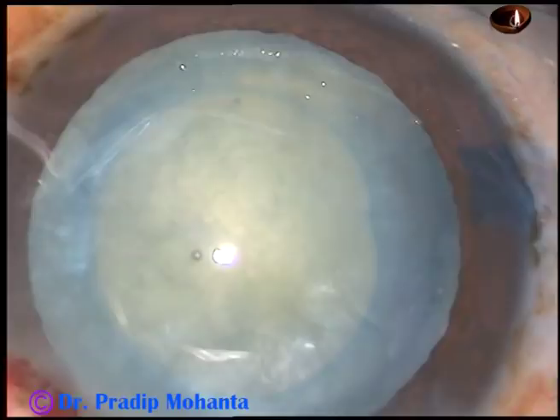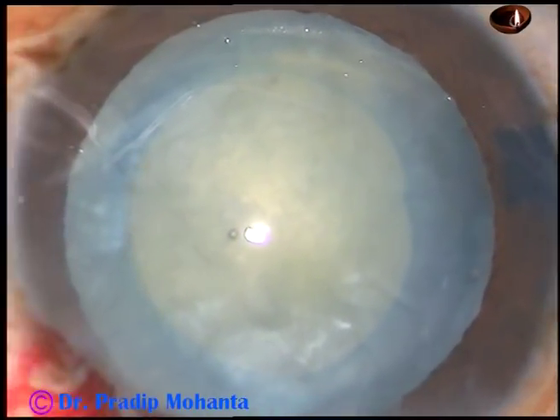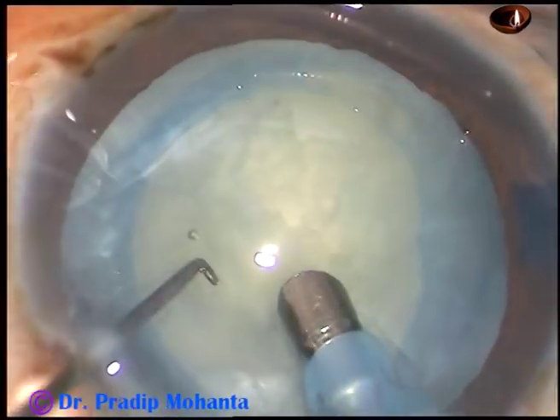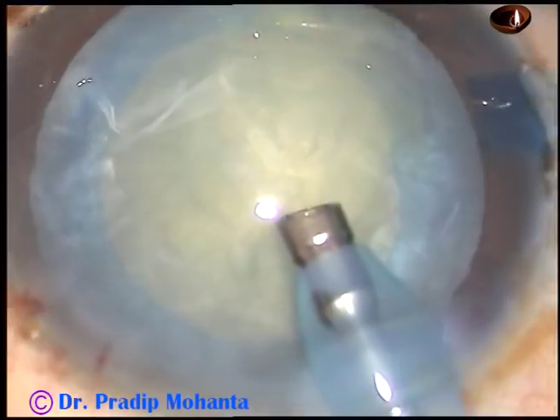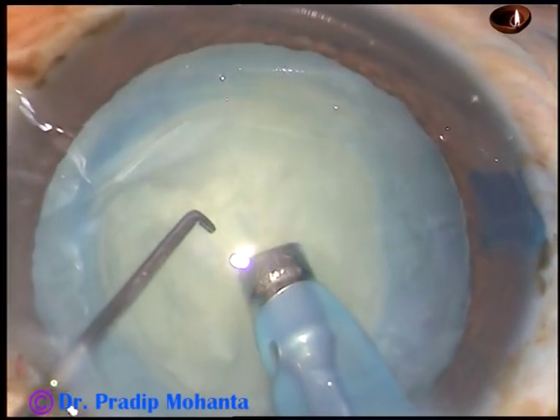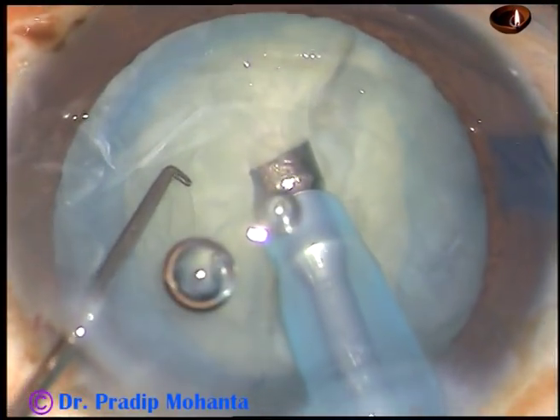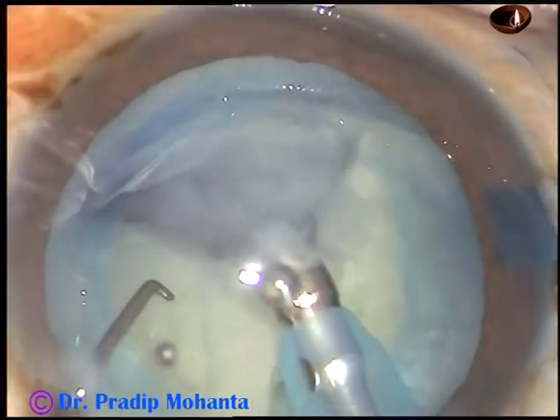Inject visco again and now is the time to introduce the tip of the phaco handpiece. The tip goes into the anterior chamber. Now turn the tip and make the bevel up. Push the nucleus little down and bury the tip into the substance of the nucleus and chop it. Hold it again and chop it at another place.